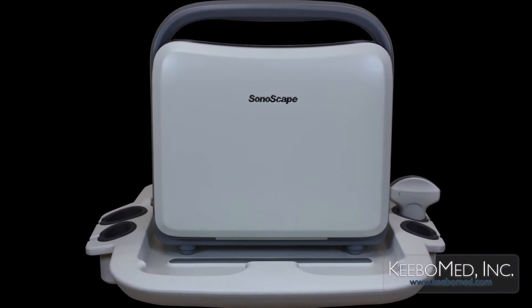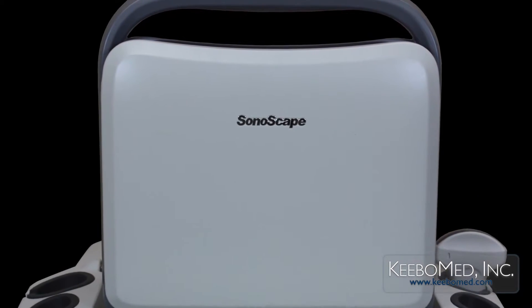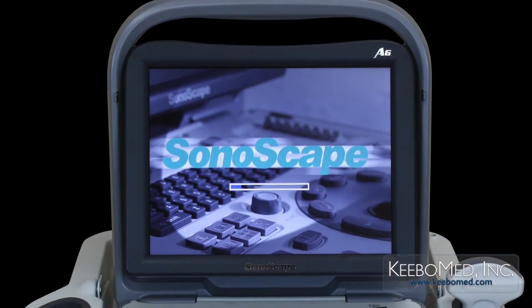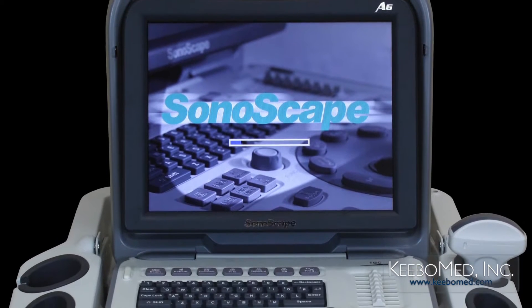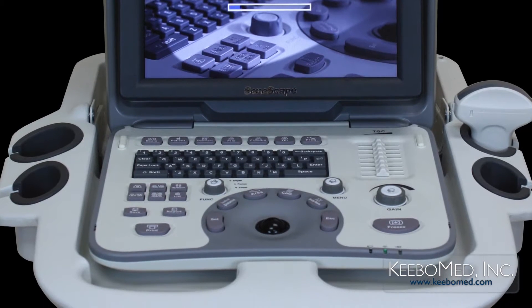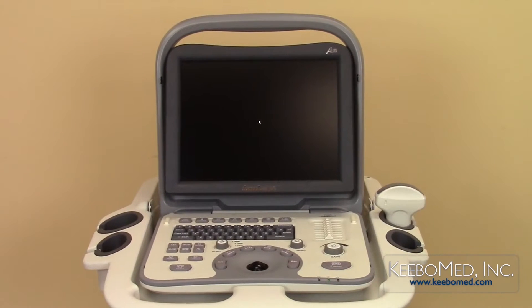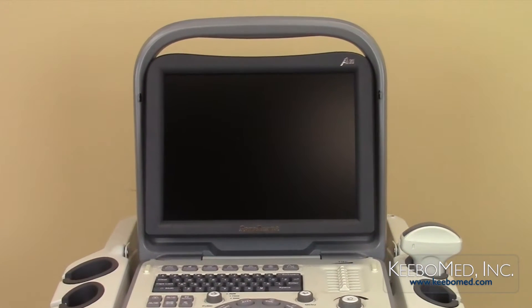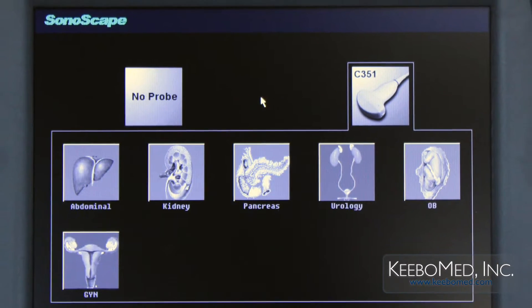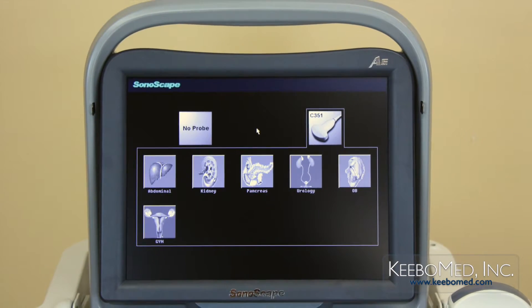The Sonoscape A6 is a full digital black-and-white diagnostic ultrasound with high performance. With state-of-the-art design and the utilization of high-performance, super-large-scale integration, this system is extremely capable of acquiring the acoustic information of human tissues. Accompanying the advanced hardware design is the Linux system, specifically optimized for medical use. It provides a solid back-end for a wide range of professional application packages and an easy-to-use graphical user interface.